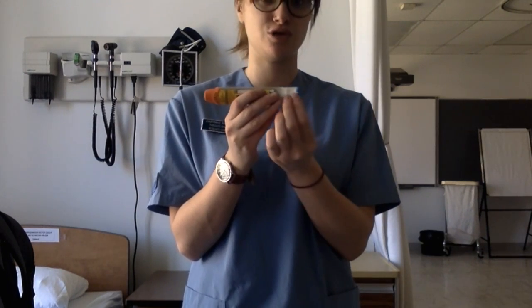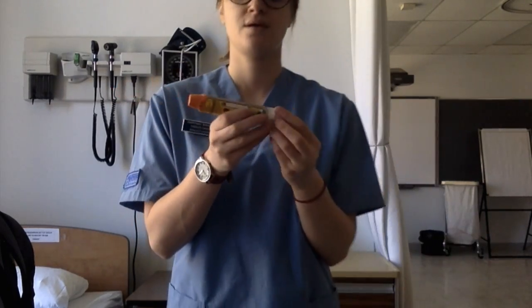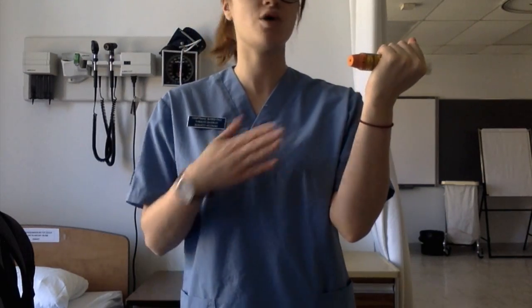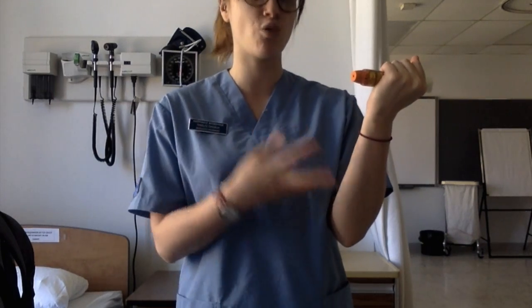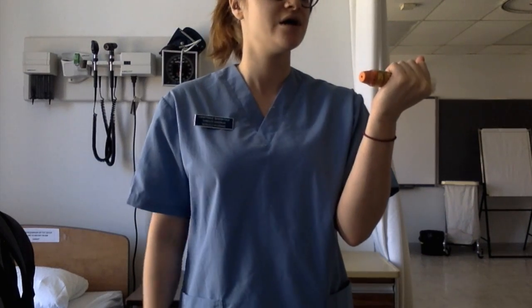The next thing you're going to do is remove the safety lock. As you can see, I'm holding the EpiPen just like so, because you don't want to, as the administrator, inject yourself by accident and waste the one dose that is in the EpiPen.